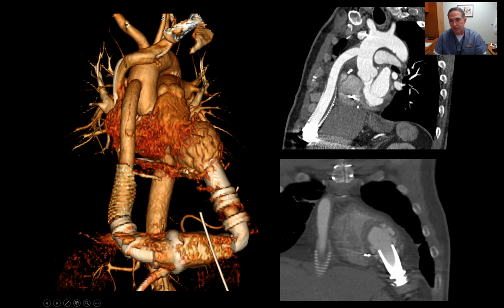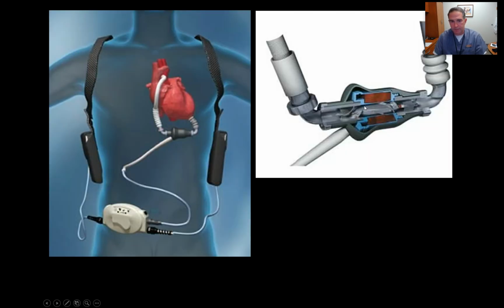into the aorta. What happens every once in a while on call, this will get called a layering thrombus, but the conduit is this thin, you can see this is the same width the whole way down. And then this is called a bend relief. The bend relief around this conduit, there's just some dead space in there that gets a little blood or whatever. So don't call that a layering thrombus inside that conduit. Just a pitfall there.